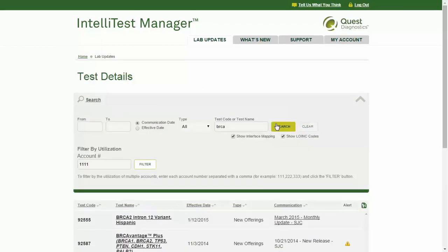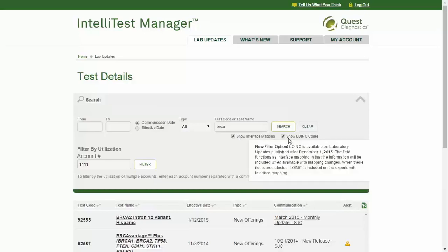If you utilize an interface, you can select the Show Interface Mapping checkbox to include interface mapping information such as result codes and result names when viewing, printing, or exporting information. When this option is selected, you can also choose to include LOINC information.